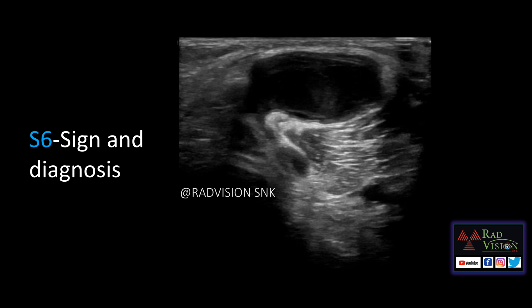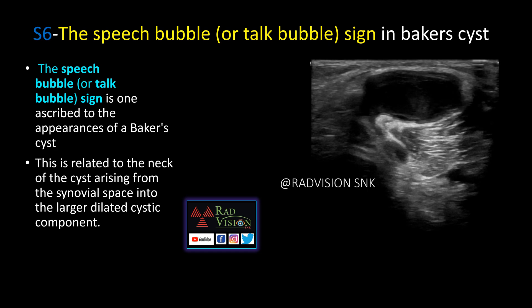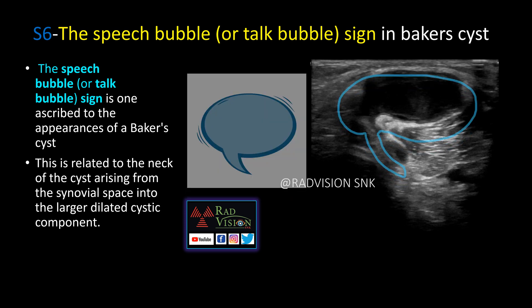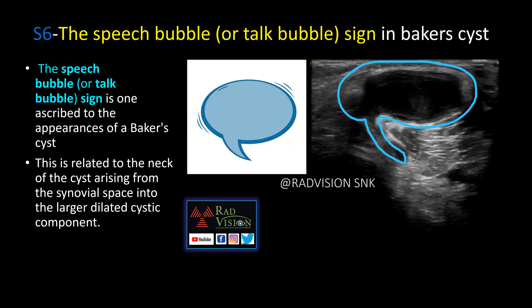Next case — here you can see the popliteal fossa. This is a case of Baker's cyst, but the sign is called the speech bubble sign or talk bubble sign. The neck of the cyst communicates with the joint space, and the cystic component along with the neck resembles a speech bubble. Remember: speech bubble sign or talk bubble sign in Baker's cyst.